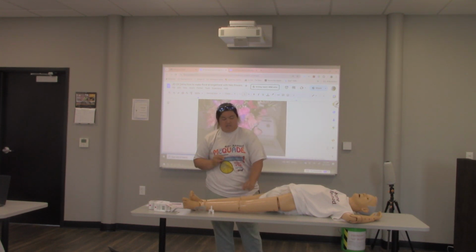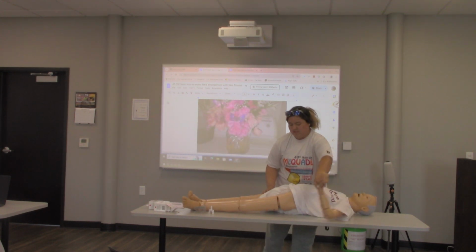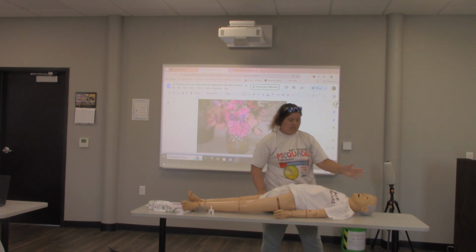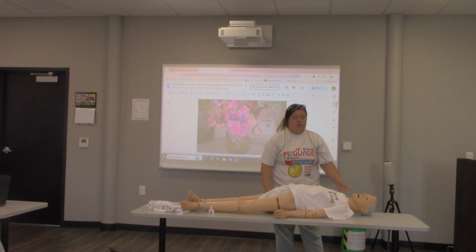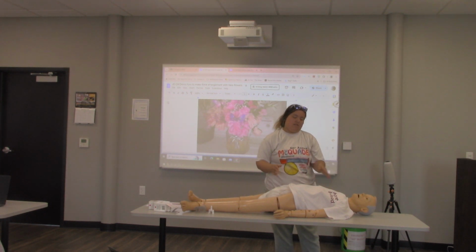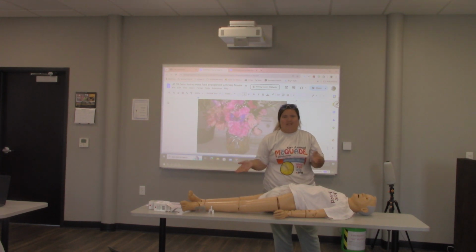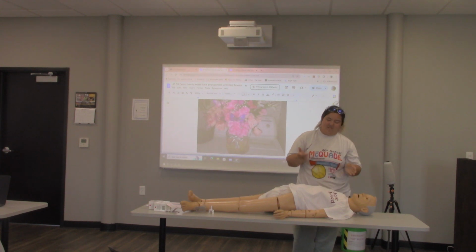So that's just something. So, just to go back through it, just make sure they're flat, check their breathing, make sure their head's straight up so that their airway can go through. Then you do 1 spray, wait 2 to 3 minutes, see if anything comes. If not, just do another spray. By then, hopefully, ambulance or someone is there. But if not, just do as many as you can.